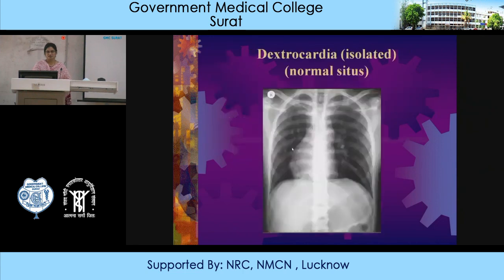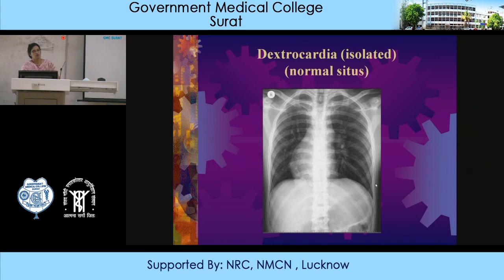This is a case of dextrocardia — whenever you find on a frontal chest X-ray that the heart is situated on the right side (on the side of the right marker), you must confirm whether there is a problem with the marker or there is dextrocardia. You can see the liver is on the right side and the stomach bubble is on the left side — so abdominal situs is normal while there is just dextrocardia. Thank you for your kind attention.